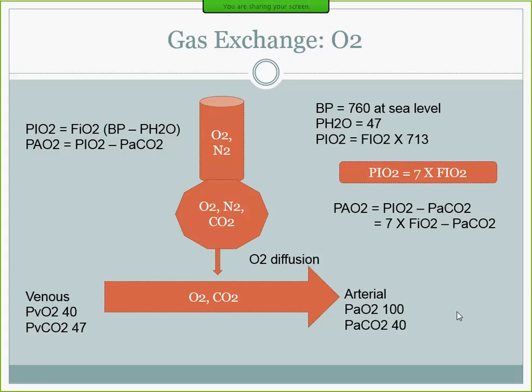Now this is not the accurate number. The actual physiological numbers are somewhat different. To make it easier, I really recommend that whenever you look at the blood gas, you always look at the arterial to alveolar oxygen difference, because that is important. Anyone can have a normal PaO2, arterial oxygen, but if the patient is requiring 70% oxygen, that's not normal for that patient. So you need to understand that, right? I always do that whenever I interpret an ABG, and you should do that, make it a habit.